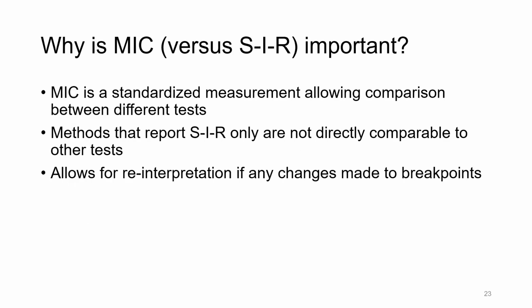So we do want reporting of a little more than just susceptible or resistant. First of all, we do want to know the species because it helps us interpret the susceptibility result. And this test doesn't actually show us something called the MIC, or the minimal inhibitory concentration. This is a number telling us at what concentration the bacteria is effectively inhibited. And if we don't know that number, it's actually quite hard to compare between tests or to reinterpret those numbers if we make some changes to what we think is the cutoff. So those are some drawbacks of this particular test, but it's exciting to see that it's such a fast test.